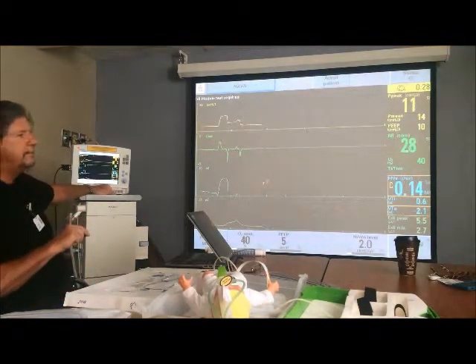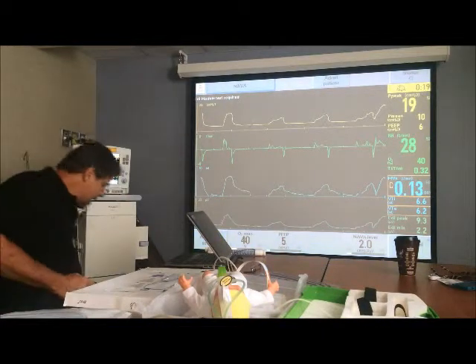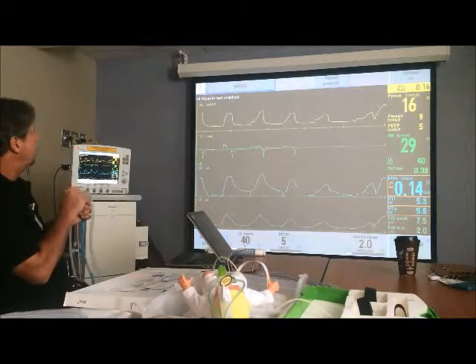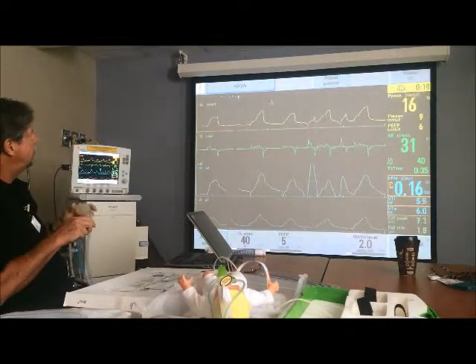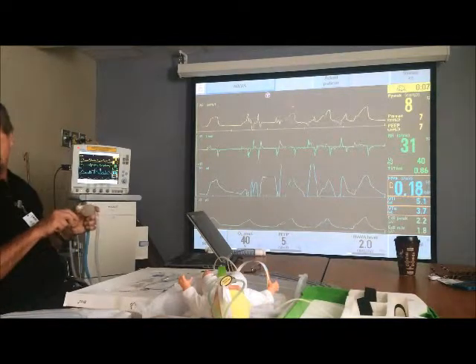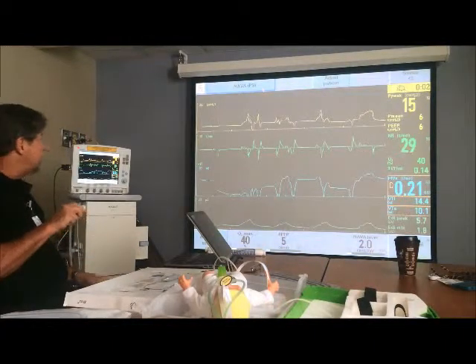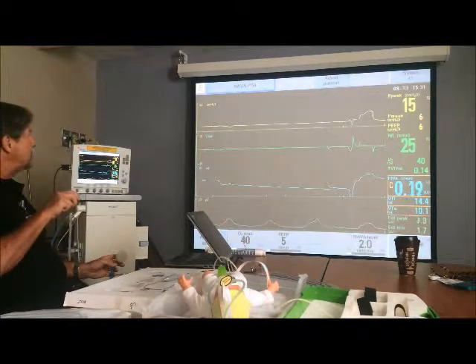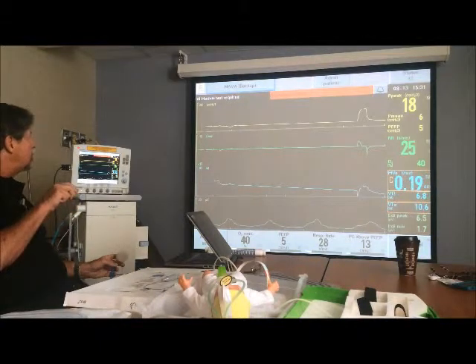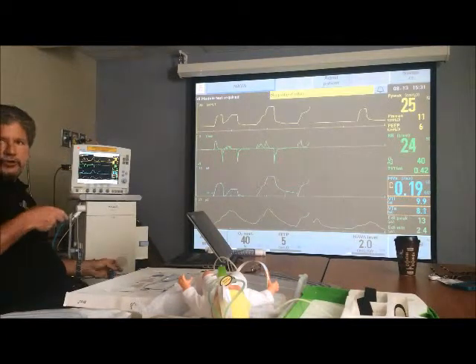and now the ventilator is in NAVA. Now whenever the EDI triggers, notice the difference in the trigger. It's a pink, or a lighter purple, as compared to that purple. See the difference? Pink versus purple. Sucks if you're colorblind. So that one is a pneumatic trigger. The ventilator says the pneumatic triggering is occurring faster than the EDI, so see how it switched to PS? What's going to happen is it goes to backup just for an instant, but then it says, oh, there's the EDI, so I'll just go back to NAVA. So sometimes it cycles through like that.